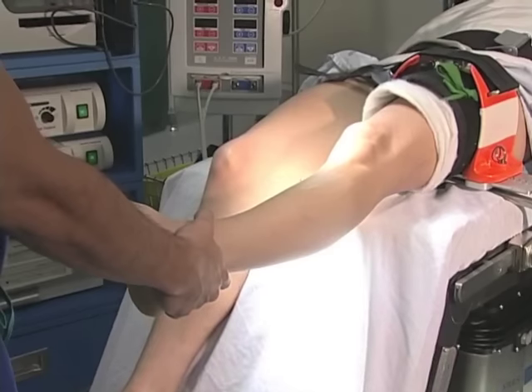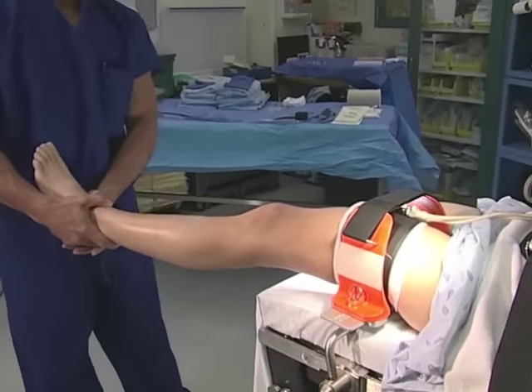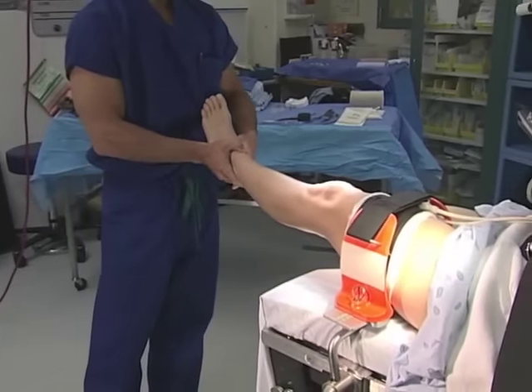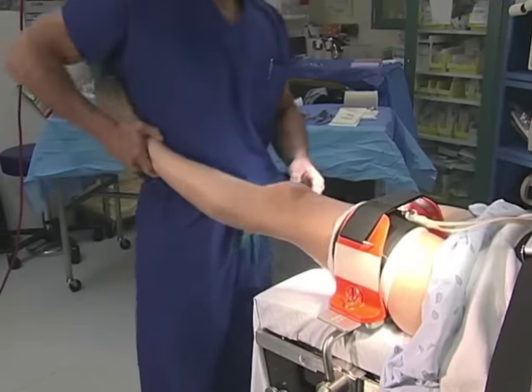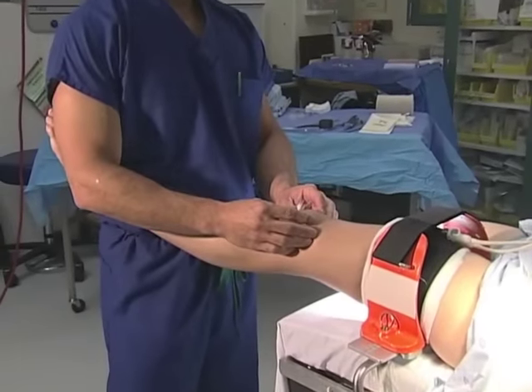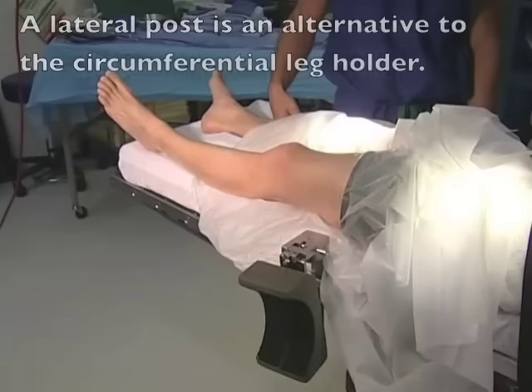A surgical assistant holding the leg may push the leg laterally or into valgus to expose the medial compartment, and medially or into varus to expose the lateral compartment. If a surgeon is operating without an assistant, the surgeon may push the leg on his hip and use his own hip to position the leg into valgus for the medial compartment or varus for the lateral compartment.